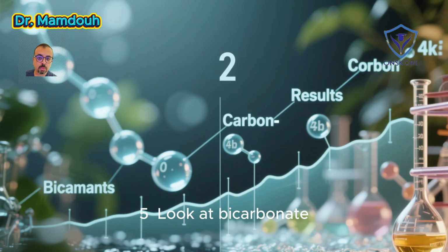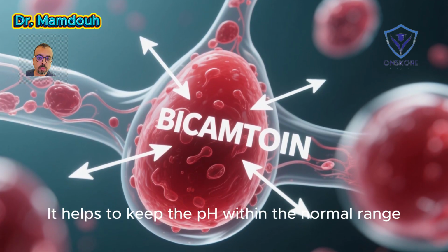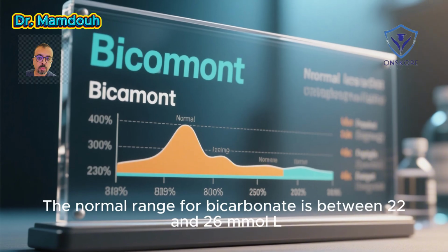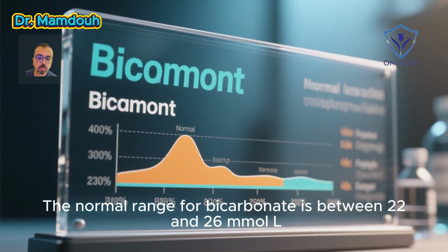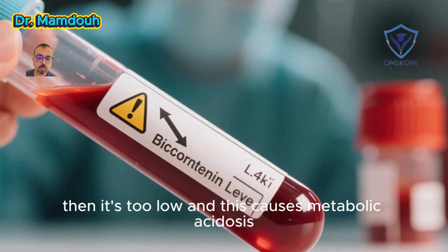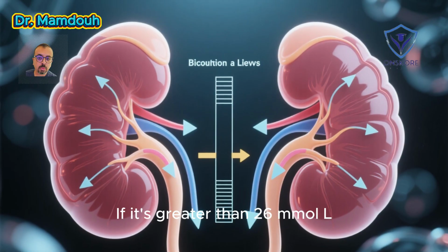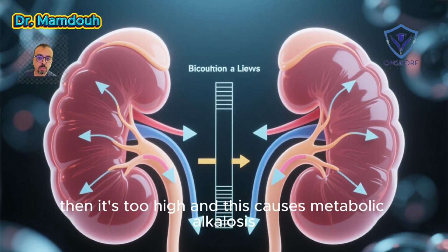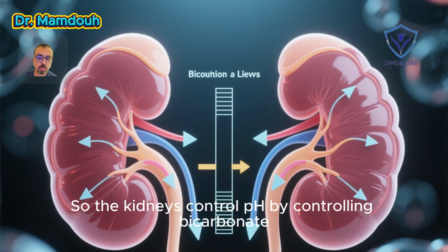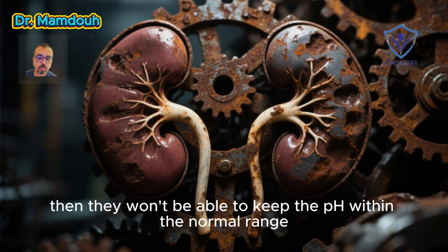Moving on to step 5. Look at bicarbonate. Now bicarbonate is a chemical that acts as a buffer in the blood. It helps to keep the pH within the normal range. The normal range for bicarbonate is between 22 and 26 mmol/L. If it's less than 22 mmol/L, then it's too low, and this causes metabolic acidosis. If it's greater than 26 mmol/L, then it's too high, and this causes metabolic alkalosis. So the kidneys control pH by controlling bicarbonate. If the kidneys are not working properly, then they won't be able to keep the pH within the normal range.